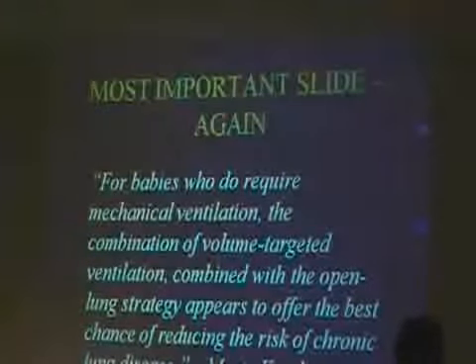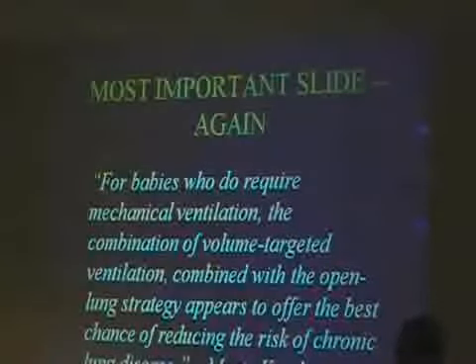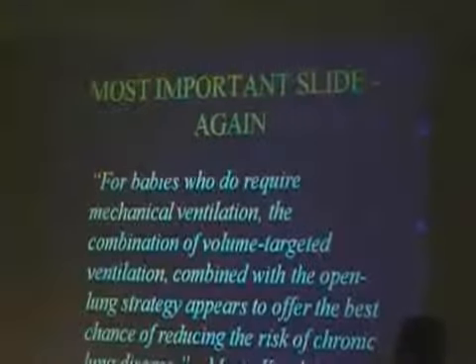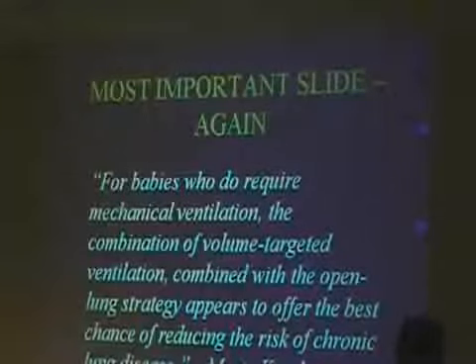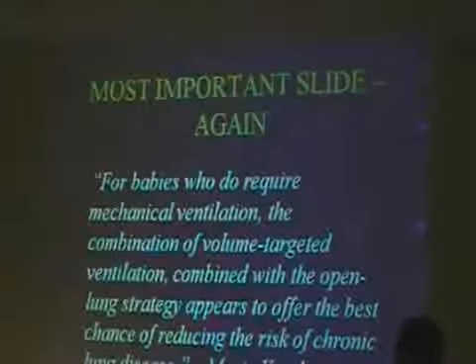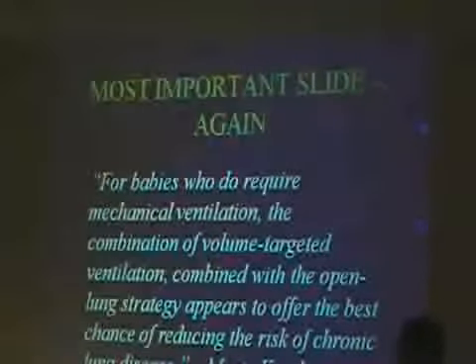Do you guys know when we're going to be up and running with in-servicing? In the meantime, we just need to be very careful and do the best we can with setting our tidal volumes. Are there some diseases that have higher volume requirements? Yes, there are, and for us, it's predominantly our BPDers. And that's a whole different game.